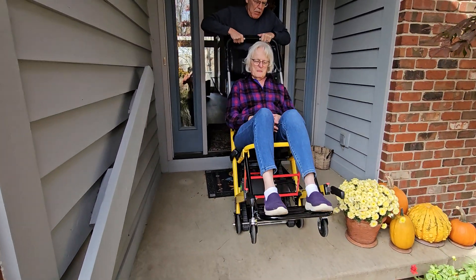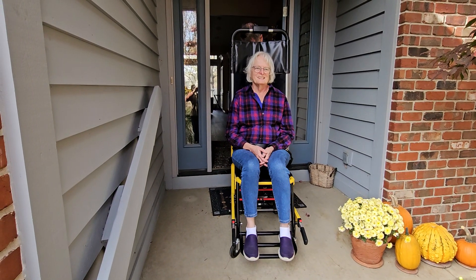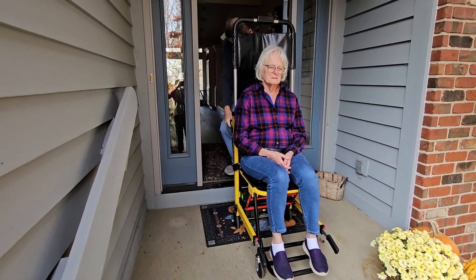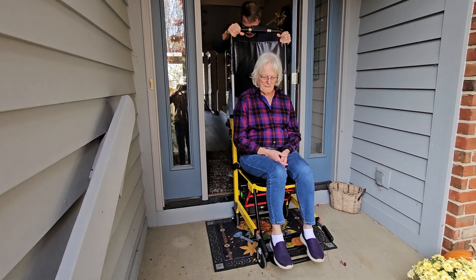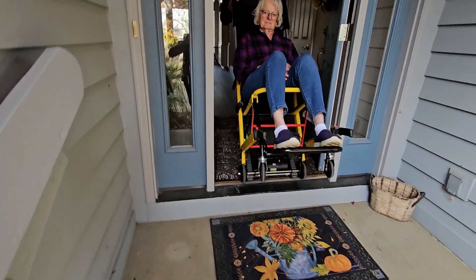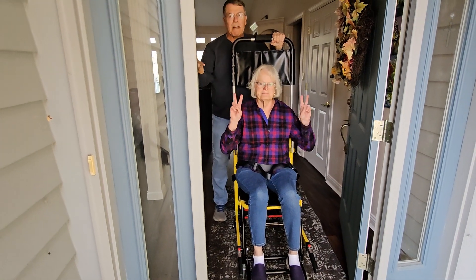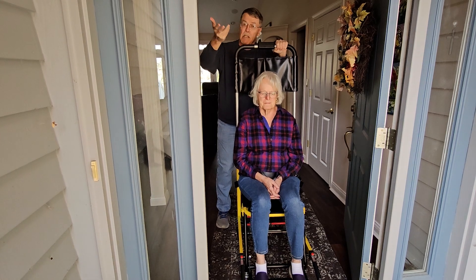We'll get up the first two steps, and then we'll pull you back to the inside. And then we'll do the same thing again. And there, you're inside the house without having to step up the steps. And then when we leave, we'll do the same thing in reverse.